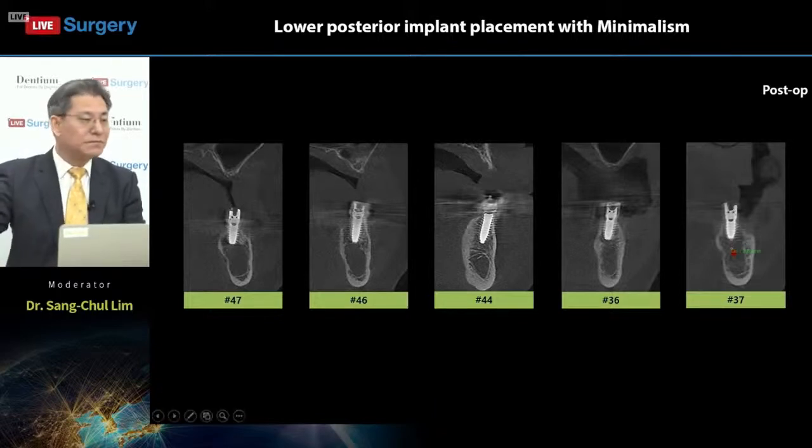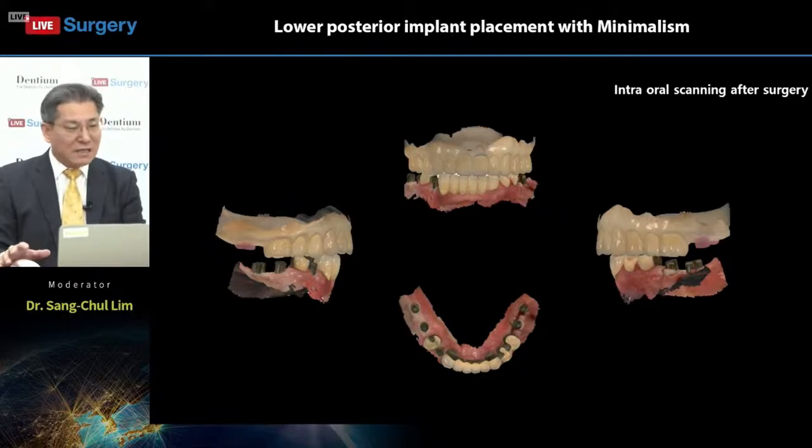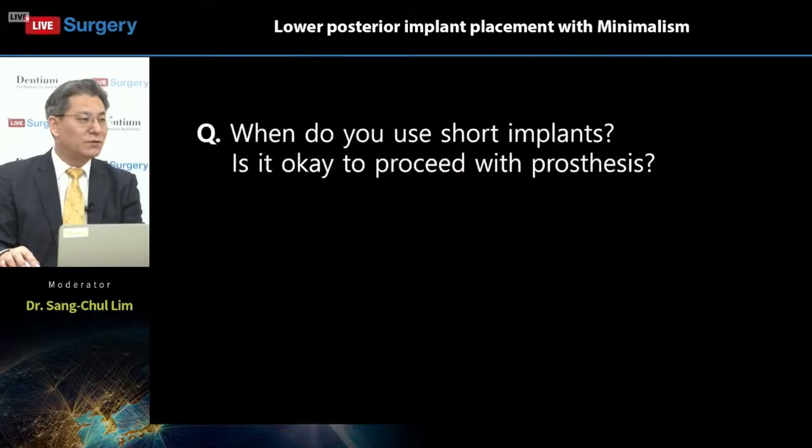Yeah, this one is intraoral scanning, the intraoral scanning view after surgery. So we can clearly see whether the positioning of the implant insertion area is proper, the ridge shape, and the implant position on the ridge. All of these things are very clear to understand on this intraoral scanning view, right?